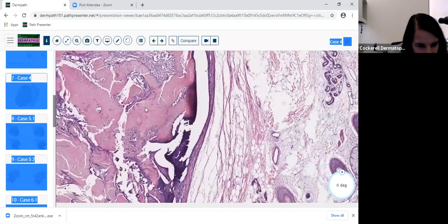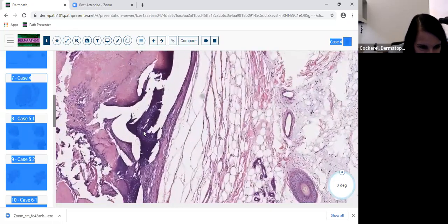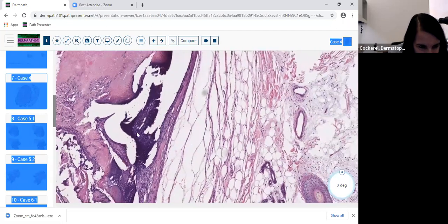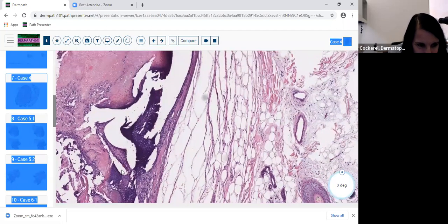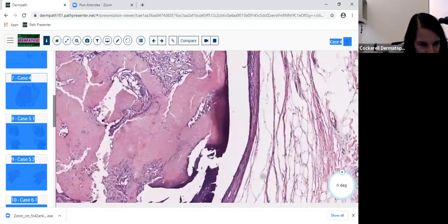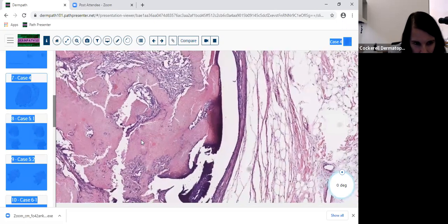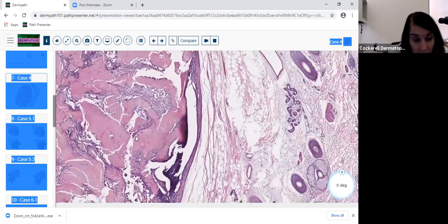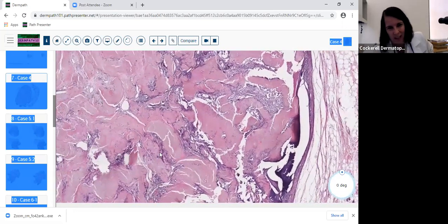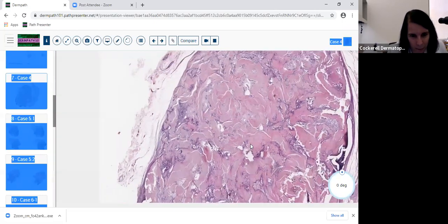So that's why you can pretty much eliminate a tricholemmal cyst here, because the basaloid cells are in a sheet, and this isn't the wall of a cyst. This is just basaloid islands. So get that tricholemmal cyst immediately out of your head, and then you see the shadow cells. You don't see shadow cells with tricholemmal cyst or proliferating pilar tumor. A pilar tumor is a proliferating tricholemmal cyst. You don't see that.